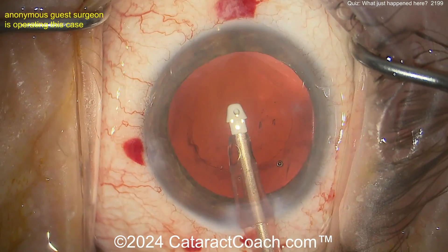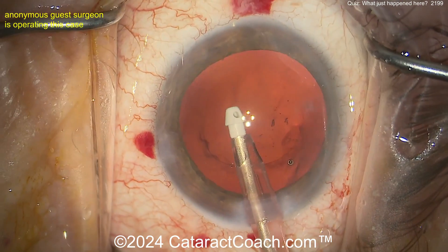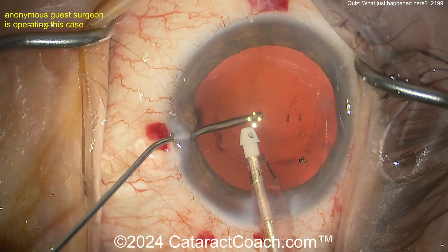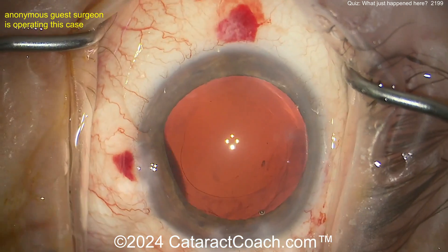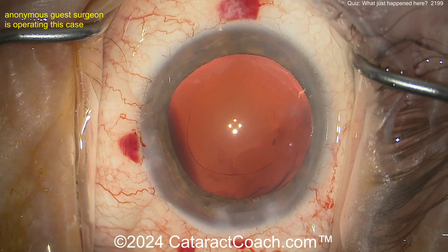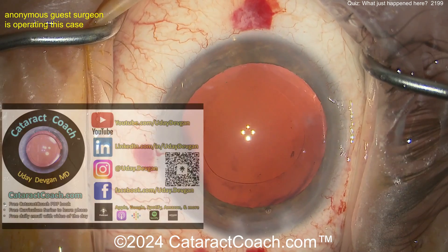That is the capsule bag equator. The IA probe suction was applied to the undersurface of the anterior capsule rim and it was pulled centrally. As a result, zonular support was broken — you had a quadrant, or clock hours, of zonular support that are lost. Now, importantly, inject viscoelastic. Super smart move here, because if you don't and you come out of there and let the AC flatten, you'll get vitreous prolapsing around that area of zonular loss.